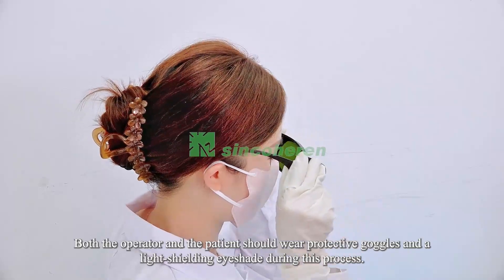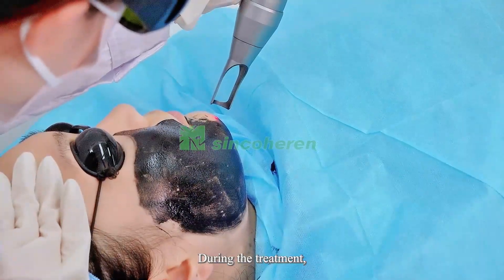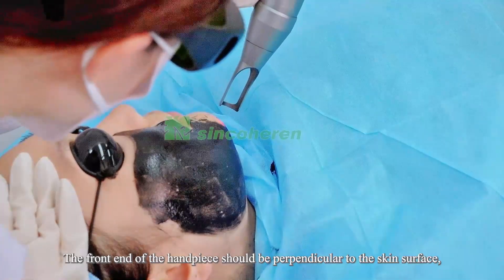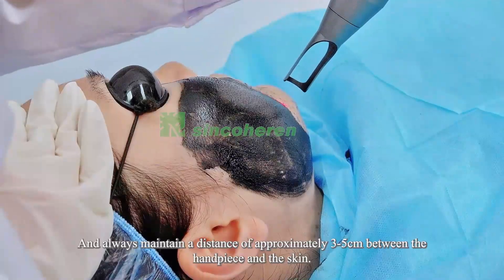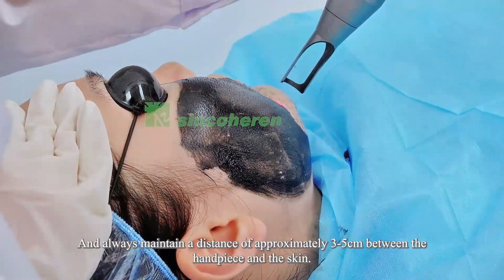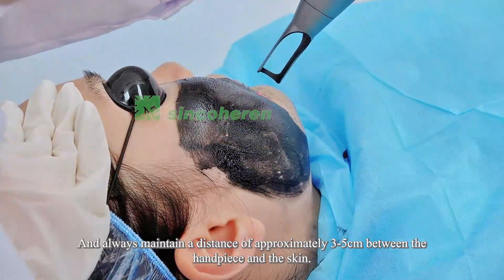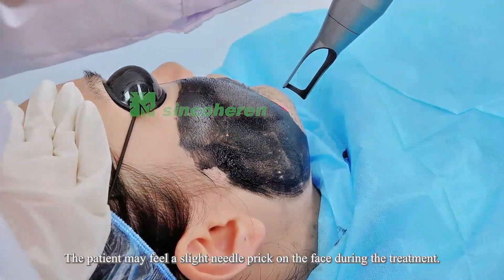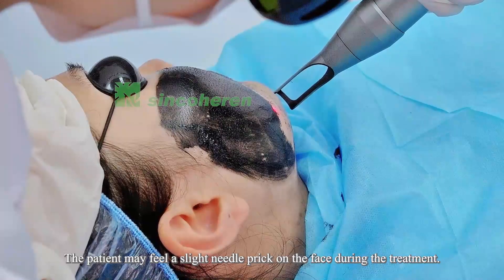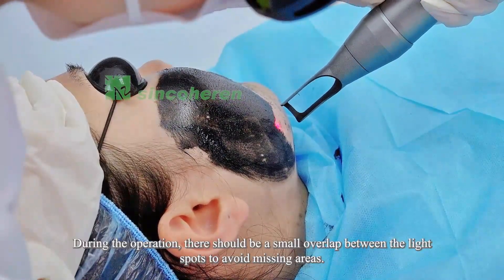Both the operator and the patient should wear protective goggles and a light-shielding eye shade during this process. During the treatment, the front end of the handpiece should be perpendicular to the skin surface and always maintain a distance of approximately 3 to 5 centimeters between the handpiece and the skin.